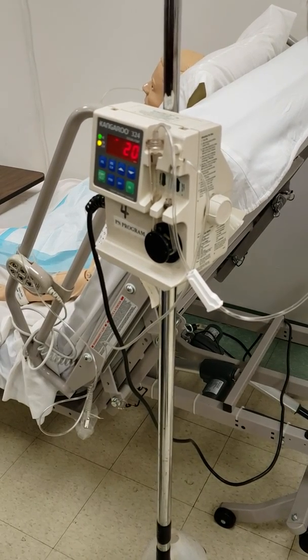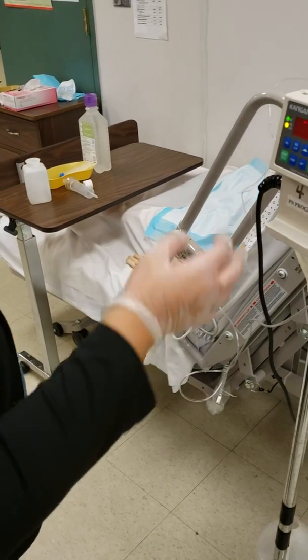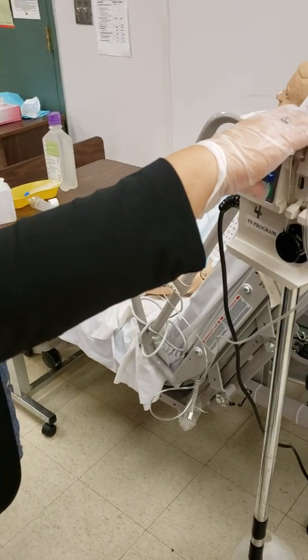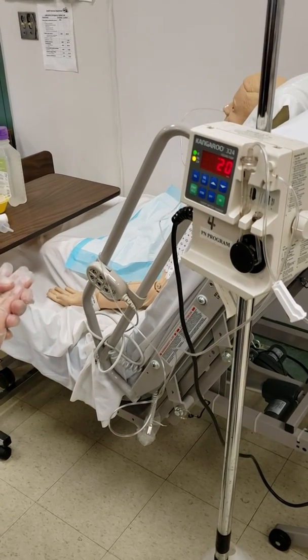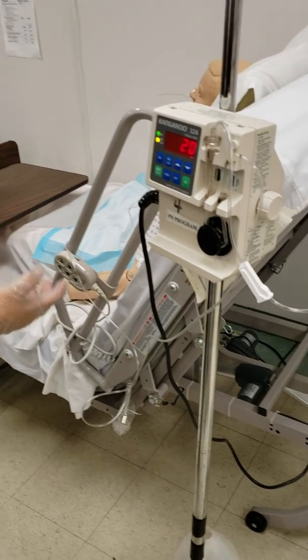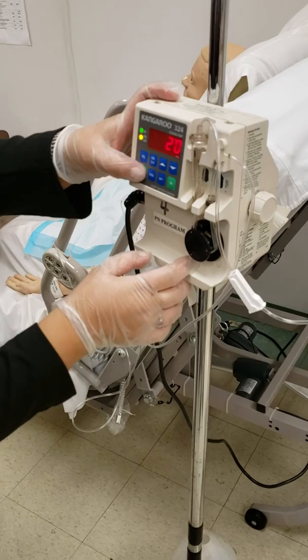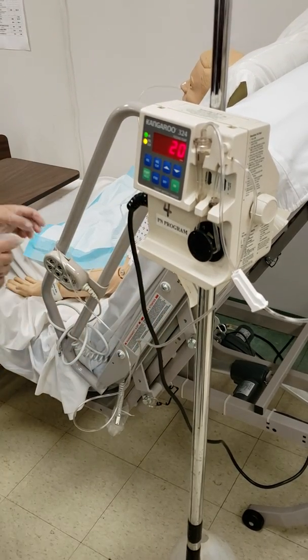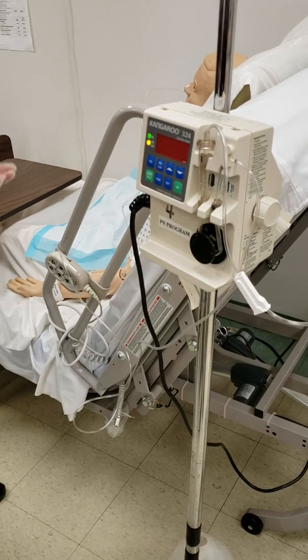Yeah. And then you will tell the teacher that after all the bolus amount is in the patient, taken by the patient, I will, of course, stop this, hold it, and then I will. You can wear another pair of gloves.